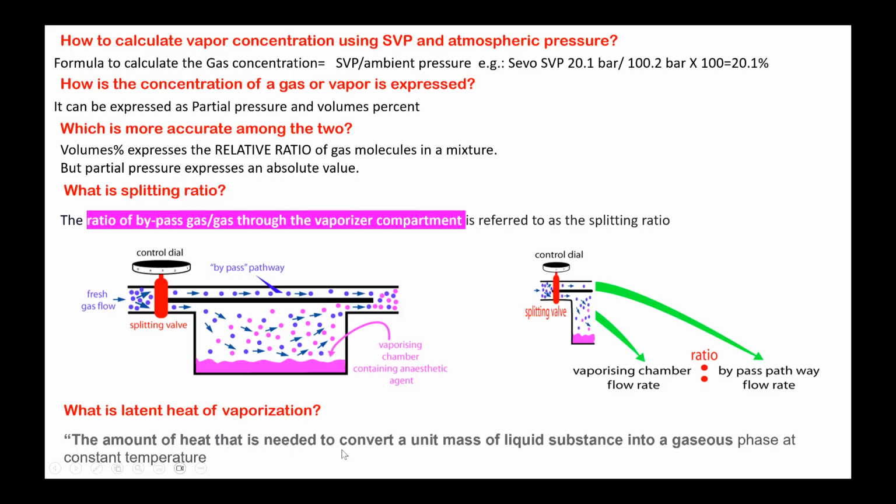So every liquid, when it is capable of becoming a vapor, supplies its own heat, as you said, by molecular collision. If you apply external heat, it becomes boiling. So the heat that is generated and supplied for the liquid to form its own vapor is hidden inside; we don't see it outside. That is why it is called the latent heat of vaporization.